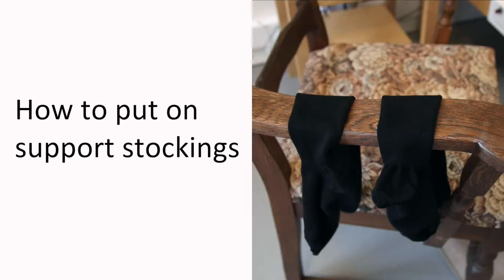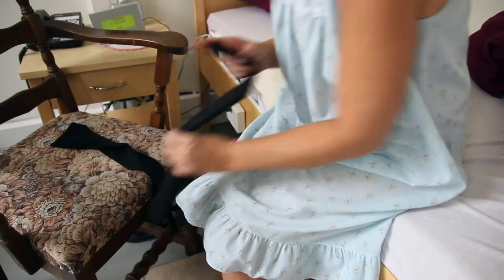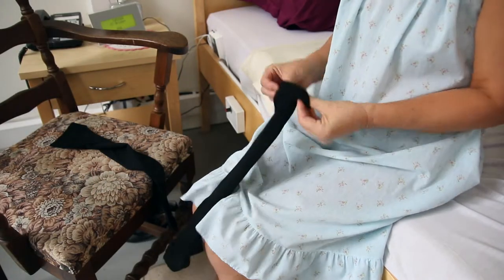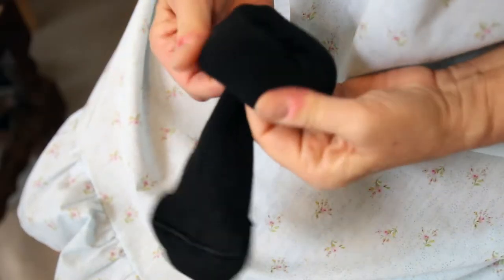We have made this video to show you how to put on your support stockings. First, you roll down both stockings like this. This will make it easier to put on.